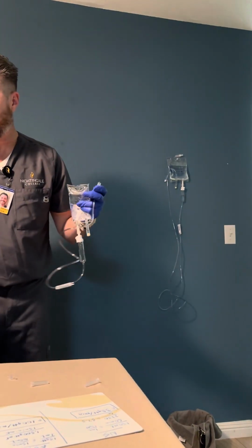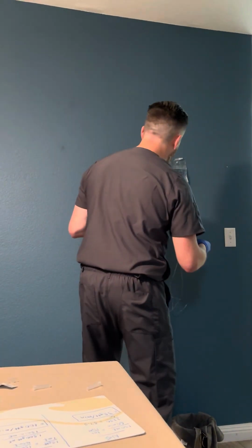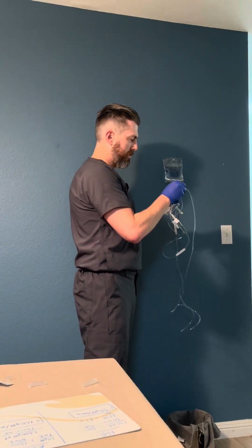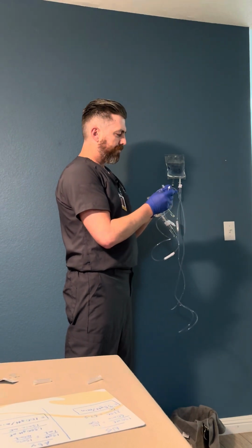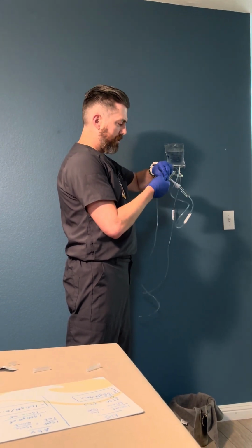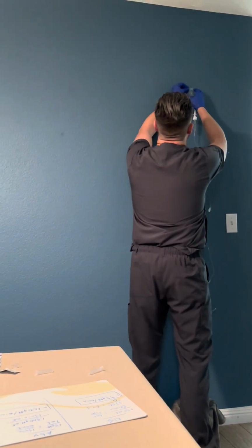I'm going to hold it in my hand, I'm not going to cap it. I'm going to use alcohol to clean the site of the port over here and let it dry. Throw it in our trash. After it's dried, I will then attach the IV tubing. Make sure it's above the other one.